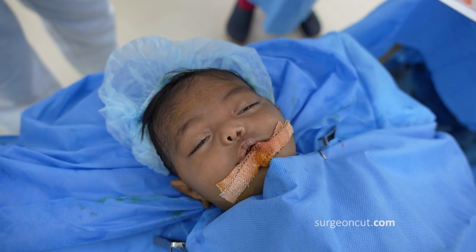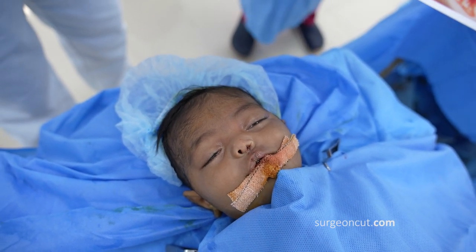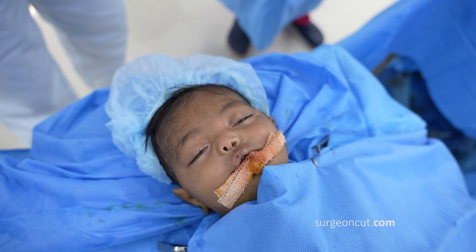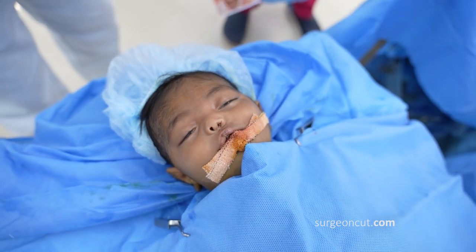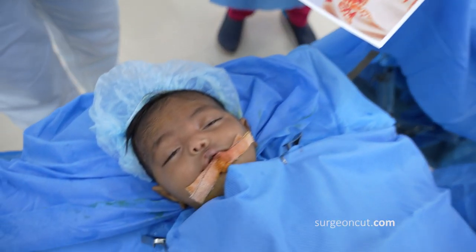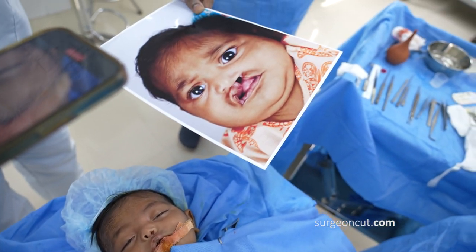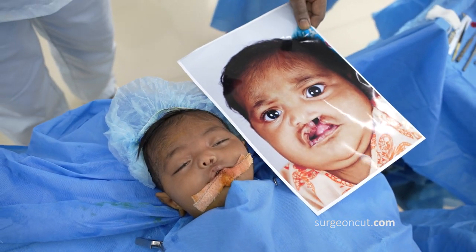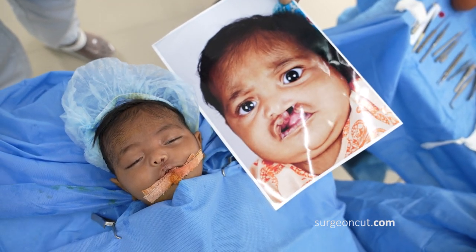That's the baby on the table. The white stitches are Vicryl Rapide — I've used both 5-0 and 6-0. These sutures don't need to be removed, but we tend to take them off on day 6, sometimes day 5 as well. Once again you can see the nice symmetry achieved for this rather wide cleft lip. We're going to show you both the before and the after in the same frame now.